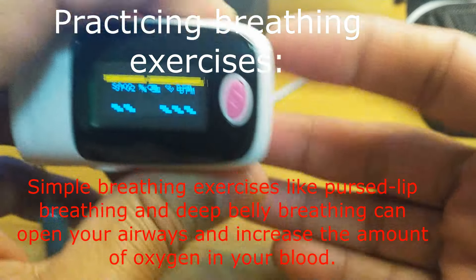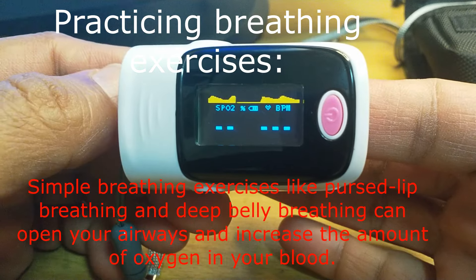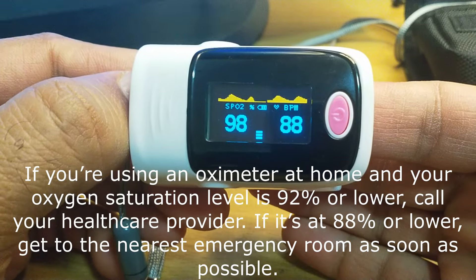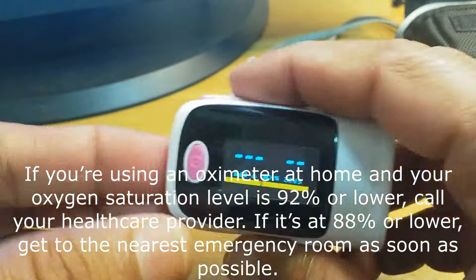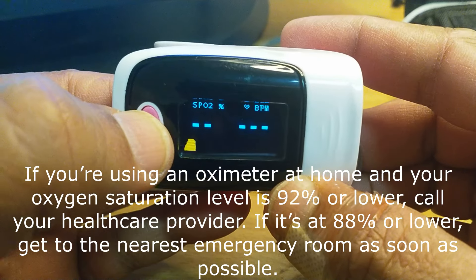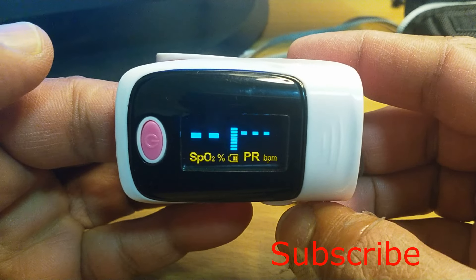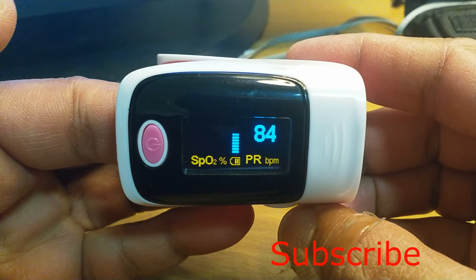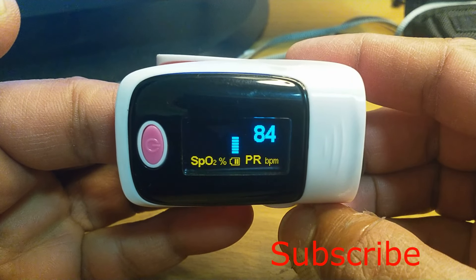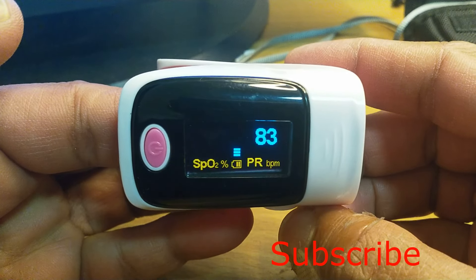I want something lower, so I will just mismatch the finger with the sensor — maybe it will show less oxygen. I will check with the other hand. Here you can also change the display direction. Now it is measuring — how much? 94. So it is less than 97, and continuously it is giving a beep.